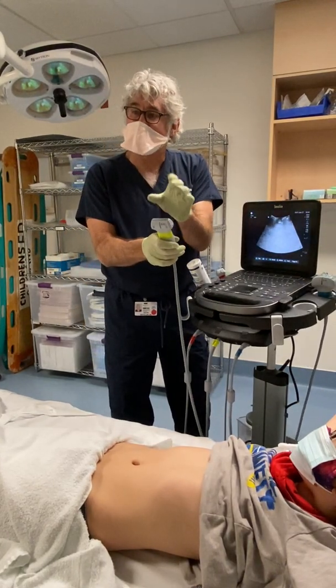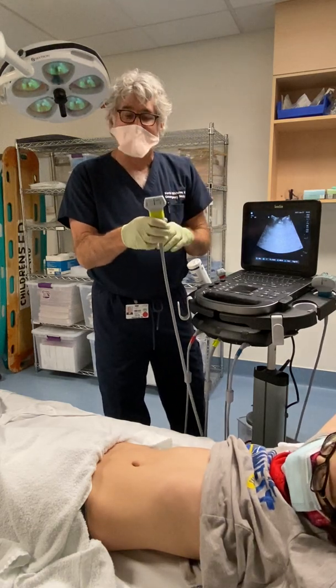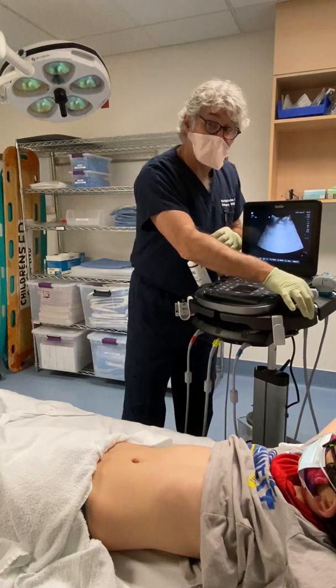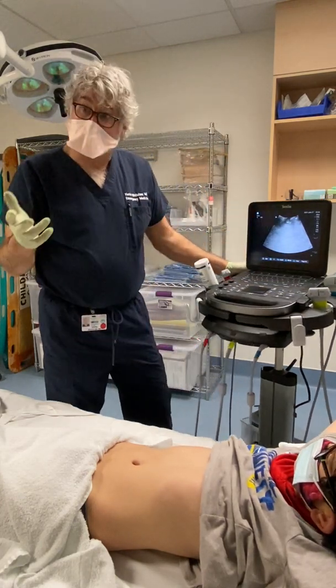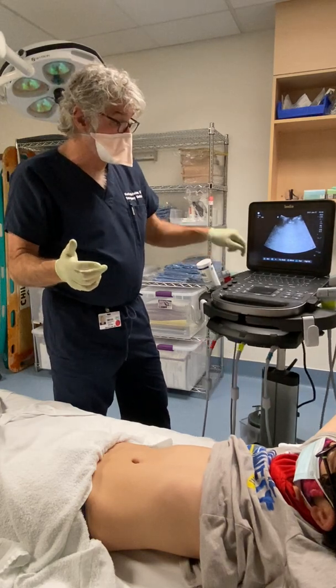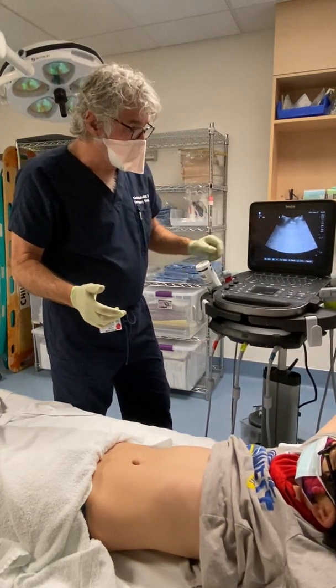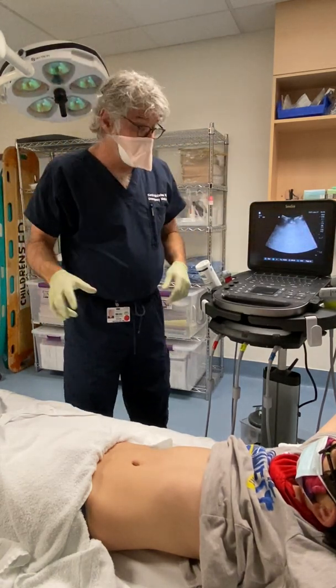You'll also be using a high-frequency probe — it's a neat little probe. It doesn't see very deep, only about four centimeters, but you get exquisite detail, so you use this for vascular access. Any probe used for vascular access on any machine is a very high-frequency probe. Today, since we're talking about bladder scanning, we're going to use a low-frequency probe — the curvilinear — because that gives us the broadest view, which is what we want.